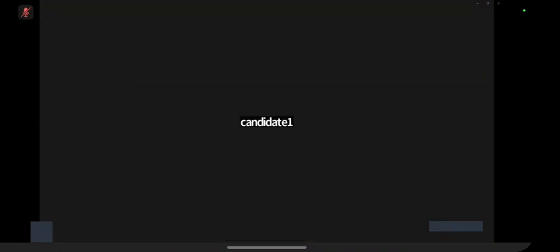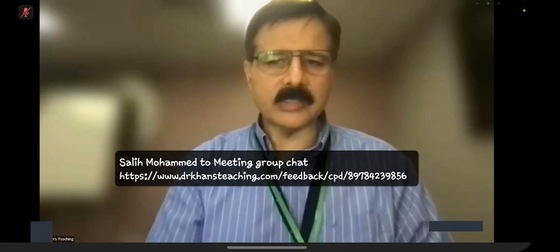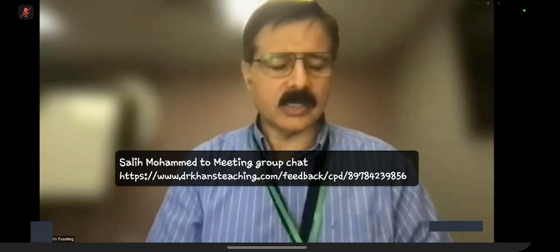There is another question. In my first case, which showed a bone island, how do I differentiate between this one and an enchondroma? So, enchondroma, the answer to your question is: develop your eyes. That is the answer to your question.